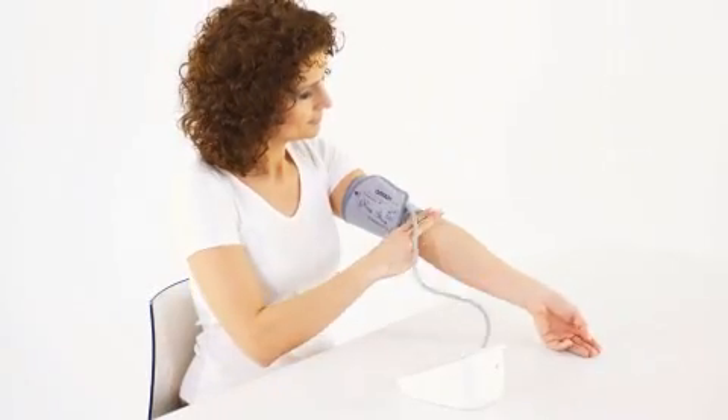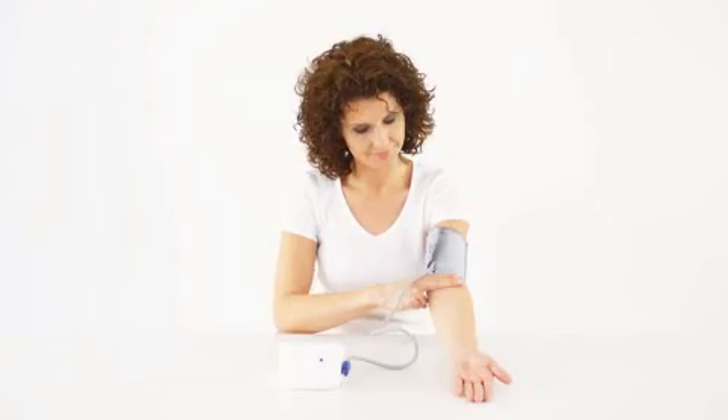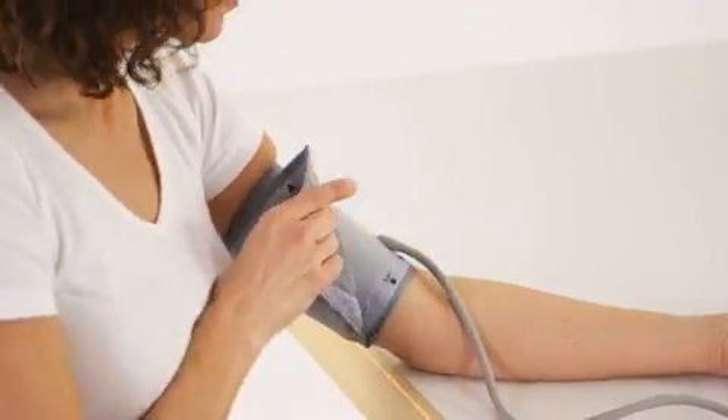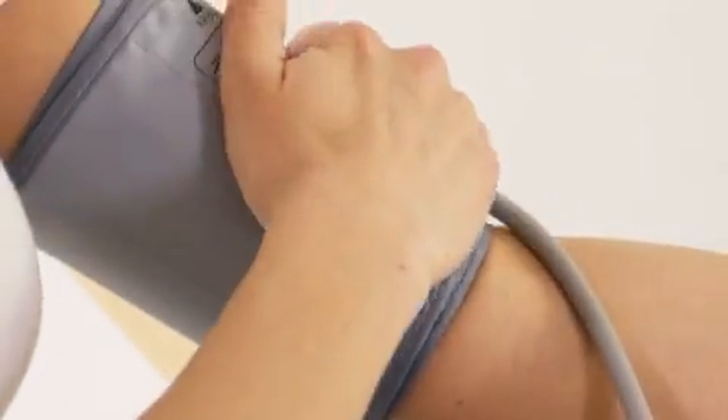Bring your arm and the cuff into the right position. Make sure that the bottom edge of the cuff is 1 to 2 centimeters above your elbow. The mark is in the center of your inside arm. Close the Velcro fastener.